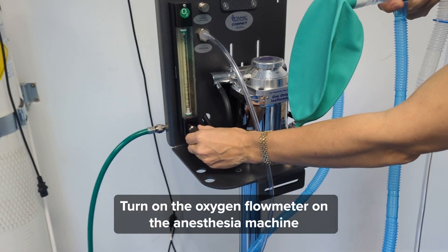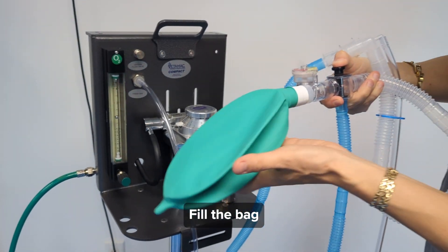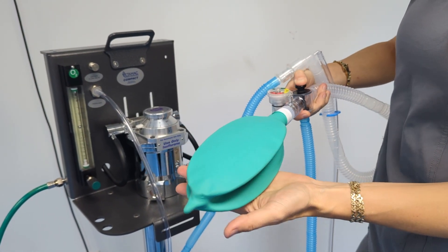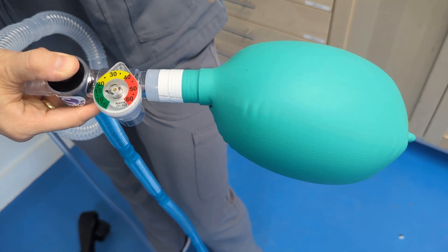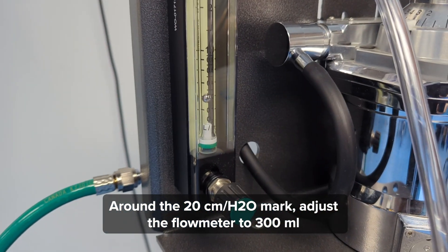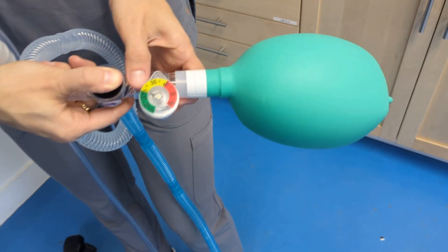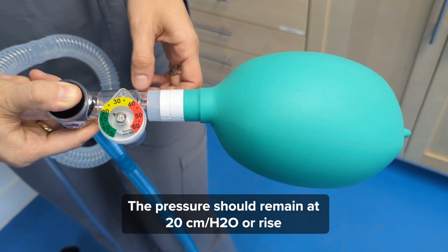Turn on the oxygen flow meter on the anesthesia machine. Fill the bag. Around the 20 cm H2O mark, adjust the flow meter to 300 ml. The pressure should remain at 20 cm H2O or rise.